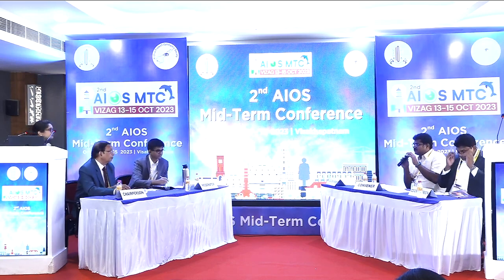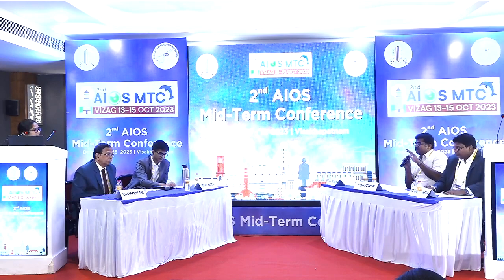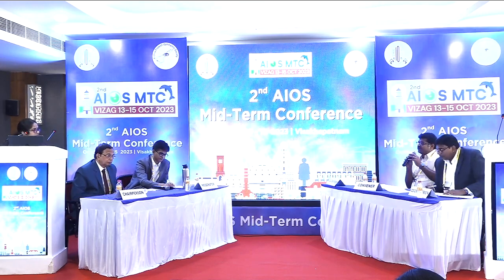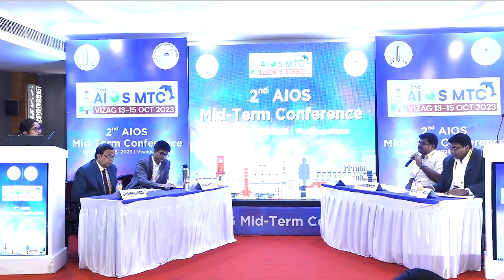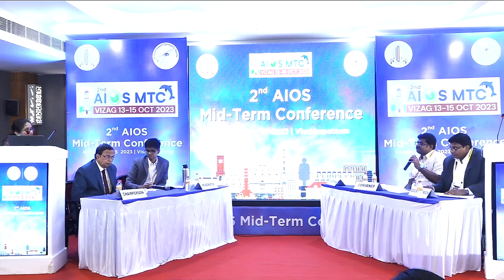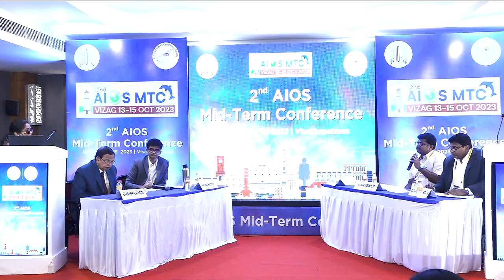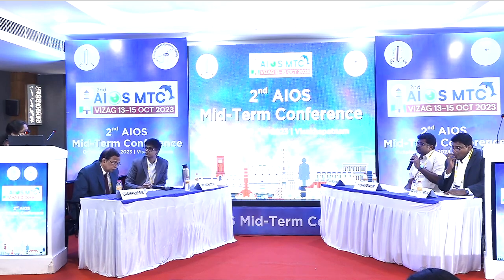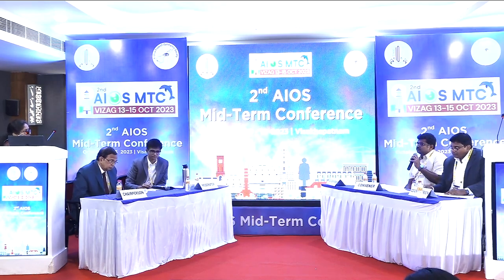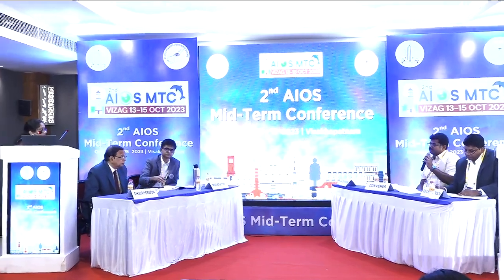Any studies done on this OCT in early diagnosis of papilledema? The papilledema is very subtle, it's very difficult to diagnose whether it's there or not. Does OCT help in that kind of a scenario? Yes, sir. We had one case in our presentation. It showed only unilateral papilledema on fundus examination. While we did OCT, it showed increased RNFL thickness in the other eye where the fundus was normal. By that we could have diagnosed that case as BIH.